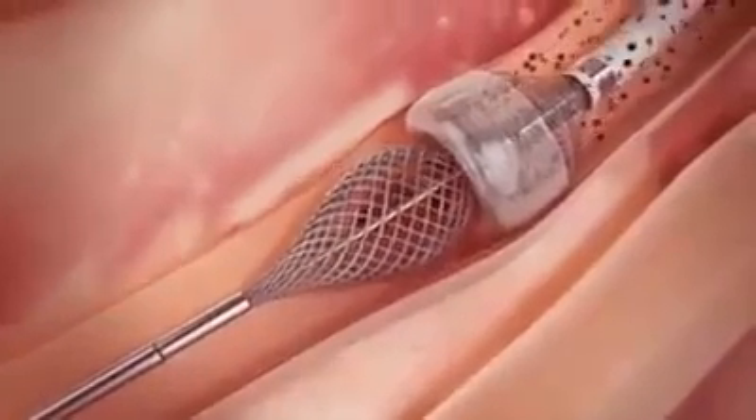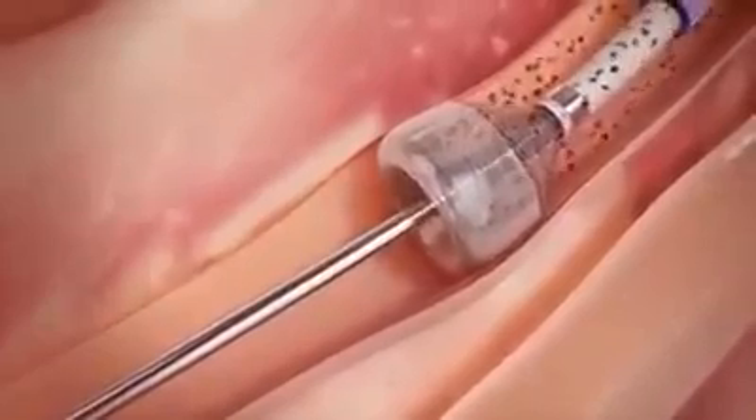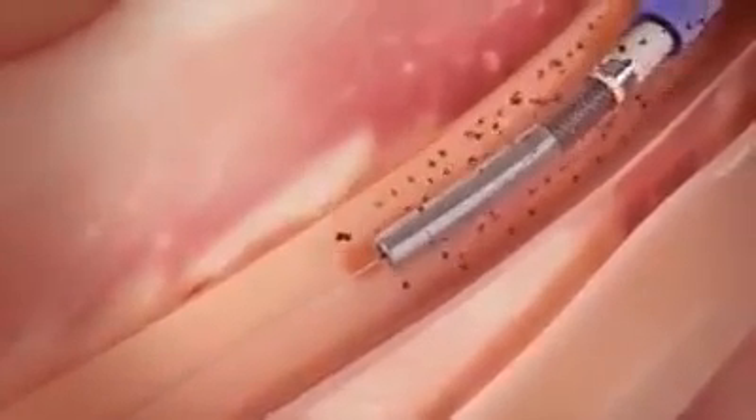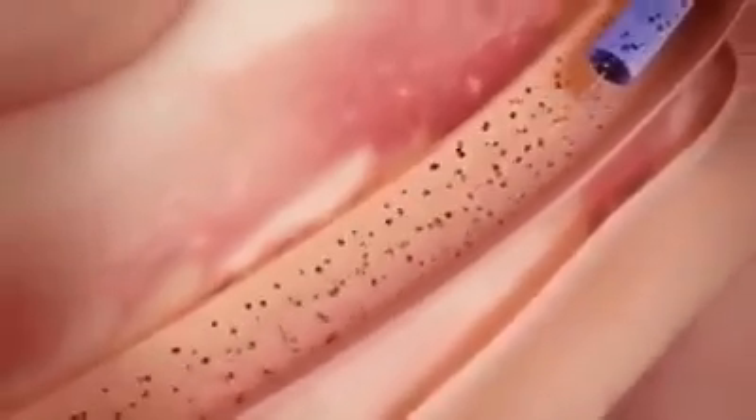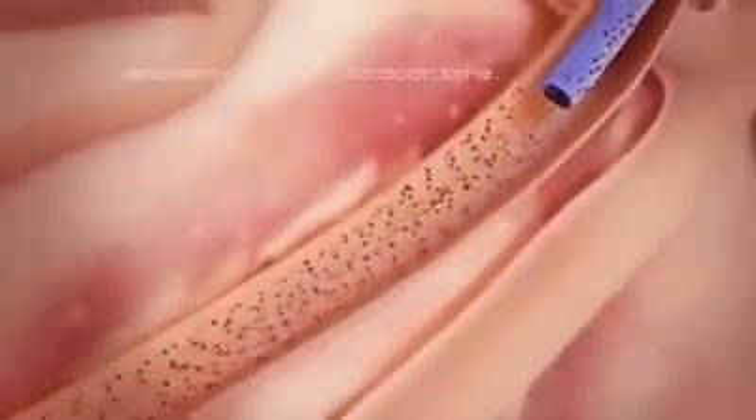After complete clot removal, suction is discontinued and the catheter tip is undeployed, restoring distal blood flow. Rapid removal of occlusive thrombus with vacuum extraction can accelerate door-to-balloon time and improve outcomes.